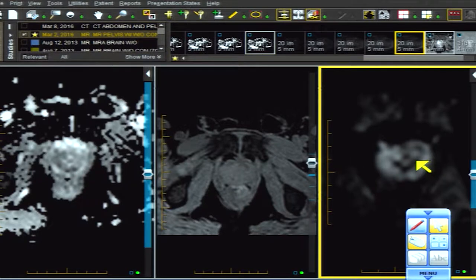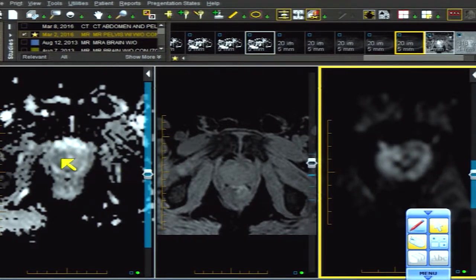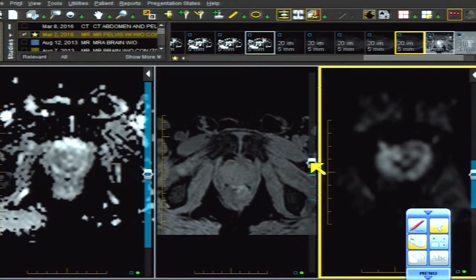All those things can produce diffusion restriction — that's why you get it in abscesses, in epidermoids, and in brain infarctions. In the right side of the gland there is very good correlation between hyperintensity and a much broader area of hyperintensity in the right gland compared with the left gland. It's a low resolution image, but it has very good correlation with the ADC map and also with the T2 spin echo image.